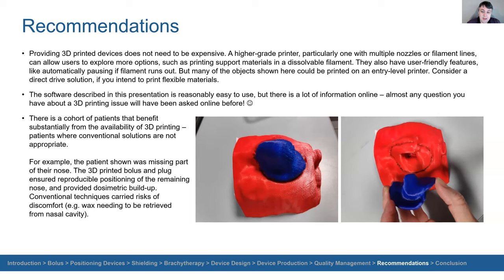I would say there's a cohort of patients that benefit from 3D printing that maybe were difficult to treat with conventional techniques. The example that I mentioned earlier in this presentation was a patient that was missing part of their nose, and forming a wax bolus here would be really difficult. Forming any sort of bolus on the patient themselves would be very difficult, and making a plaster cast would be difficult just because there'd be that risk of an object maybe falling into that cavity, particularly an object that might not have mechanical integrity.